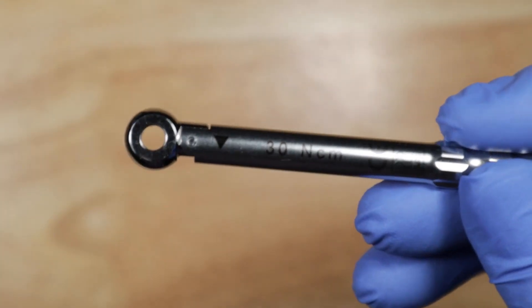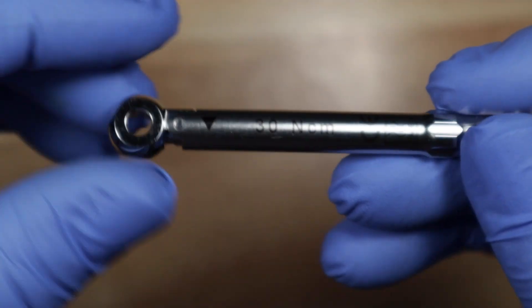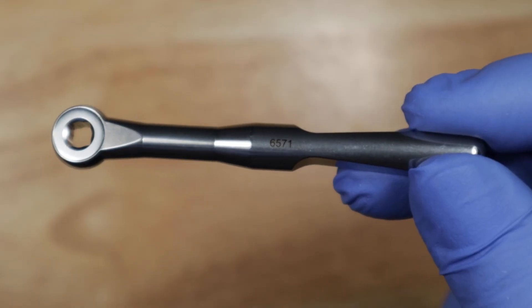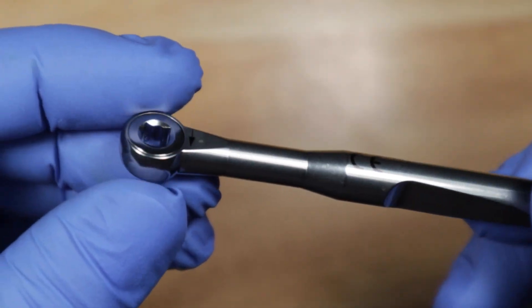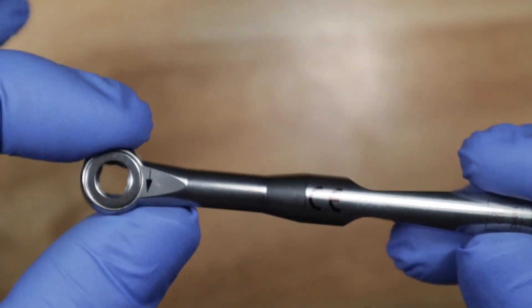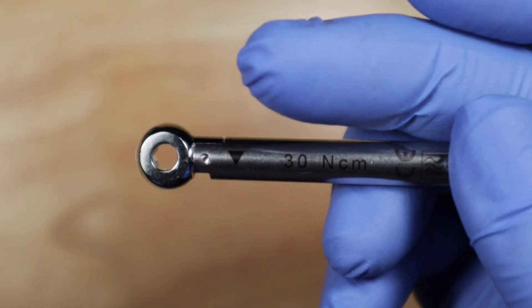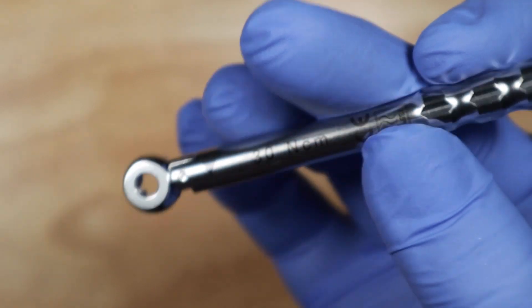And lastly, don't confuse this with the surgical torque wrench. So this one has a torque setting at 30 newton centimeters. The surgical one that comes in your surgical kit actually does not have a torque setting. So this can actually torque to infinity, right? So this one will over torque your abutment. This one will not. This one says 30 newton centimeters. This is the prosthetic wrench.